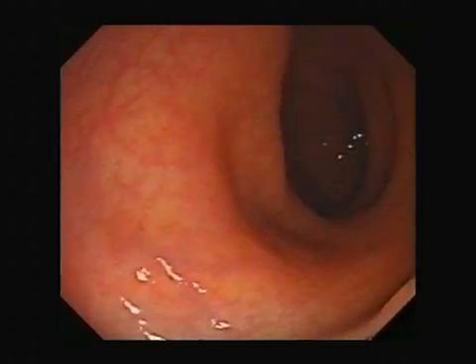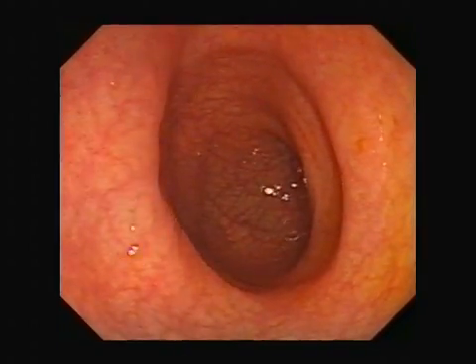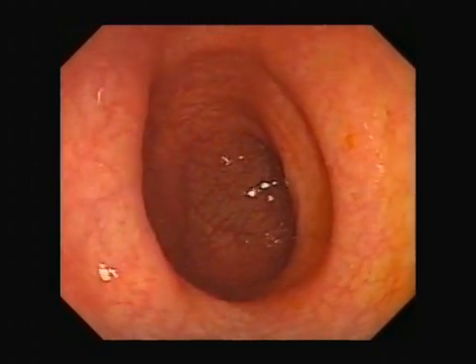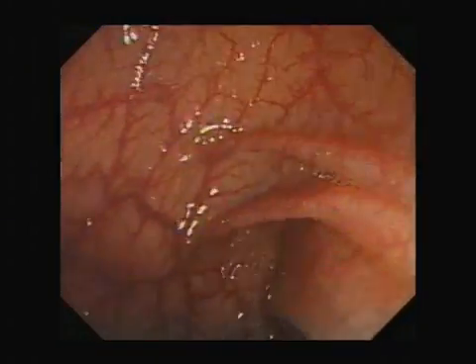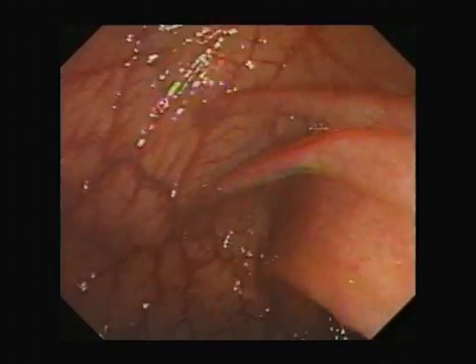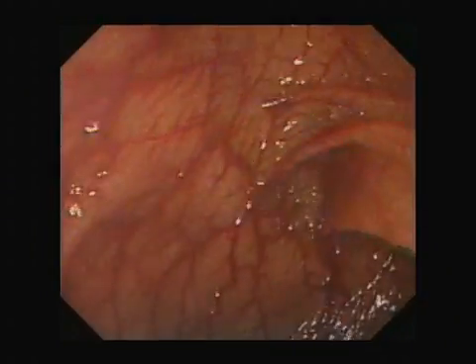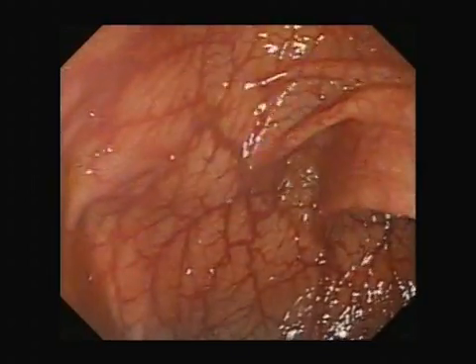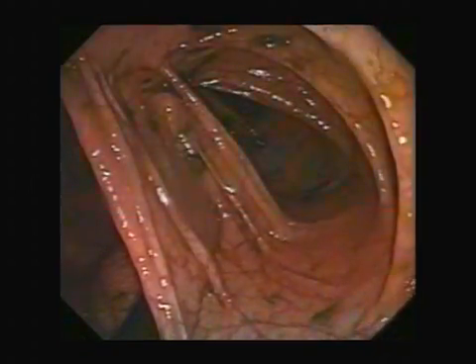Major vessels are visible too. In the sigmoid, the single pulse of the left iliac artery. In the transverse, the impulse of the aorta can sometimes also be seen. Or the double impulse of the heart against the diaphragm.